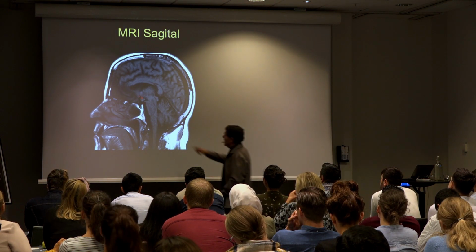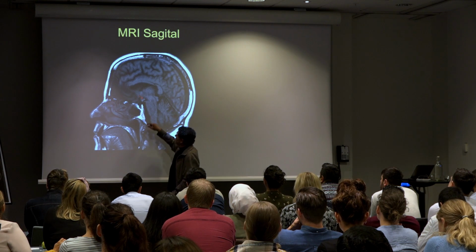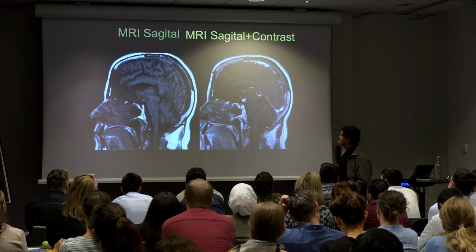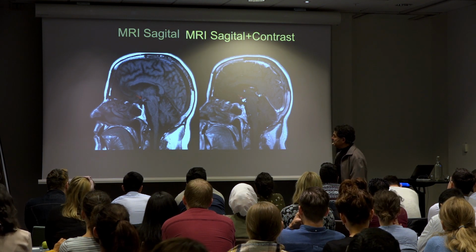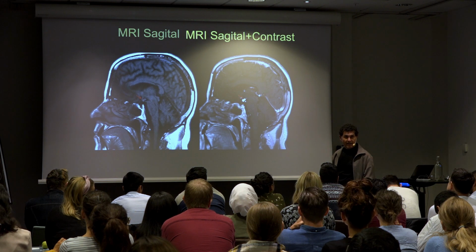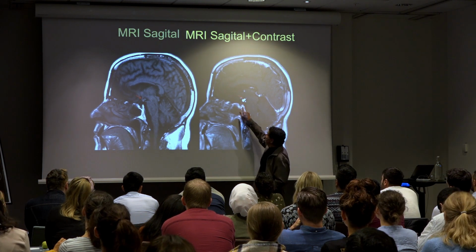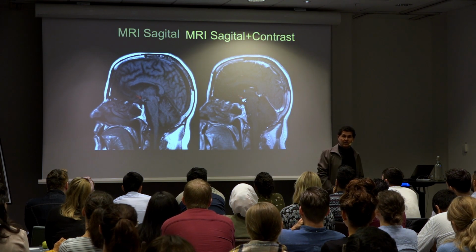Here's the mid-sagittal, here's the aqueduct. There's no pituitary tumor, but there's something there that they call normal, and then with contrast, it's enhancing. So what is that? If it's bleeding, it wouldn't enhance with contrast. A microadenoma? A macroadenoma is a big pituitary tumor, but there's nothing originating from the pituitary. You see space here. So here's the infundibulum. So the question is, what enhances in that location?